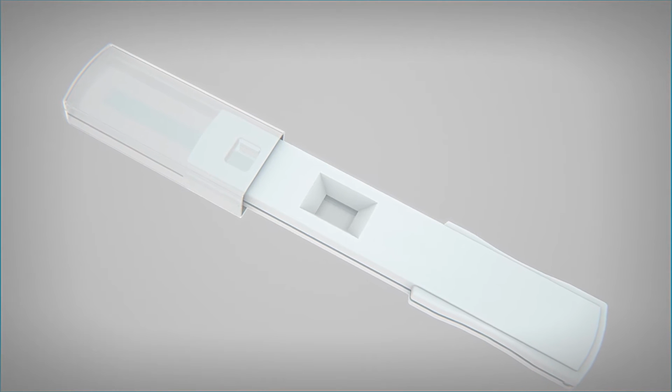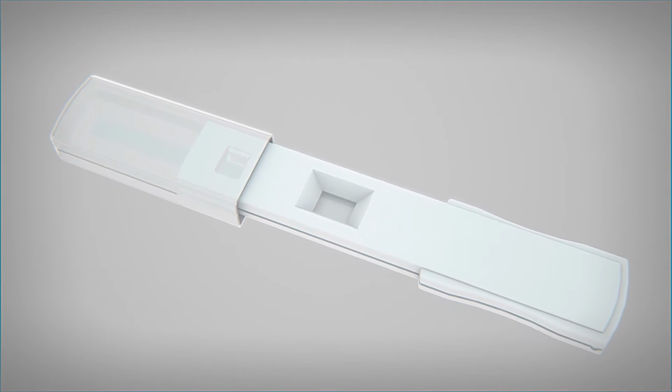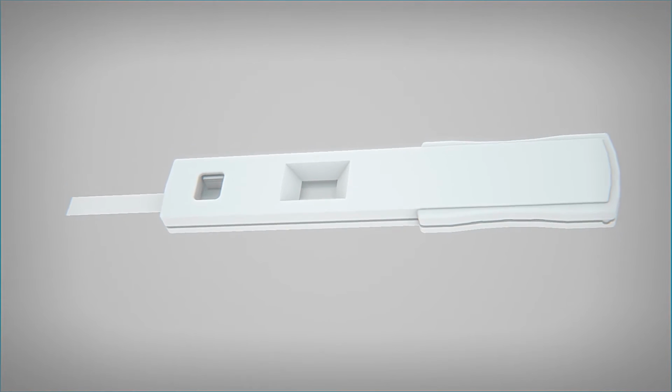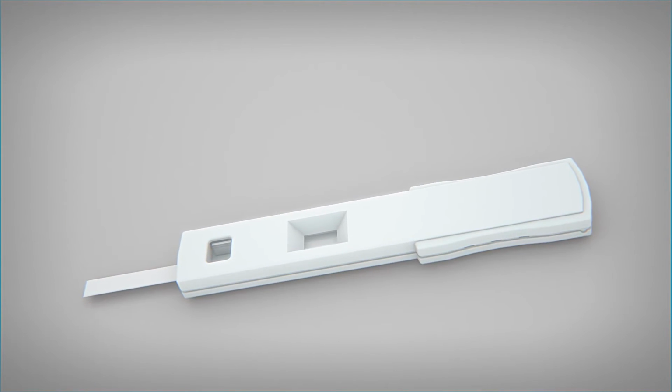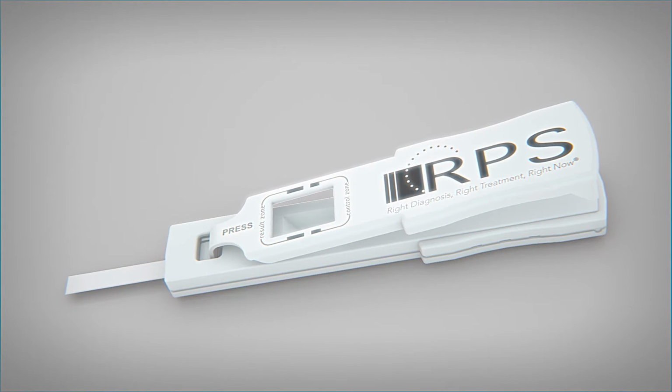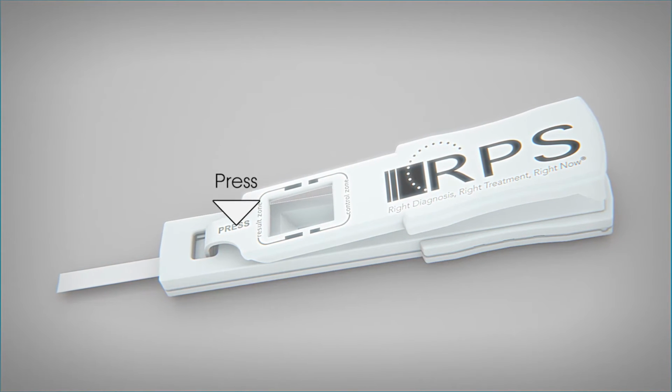Step 2 is assembling the test. Locate the test cassette and remove the protective cap from the test. Assemble the test by gently placing the sampling fleece into the sample transfer window of the test cassette. Press firmly where indicated until the test feels secure.